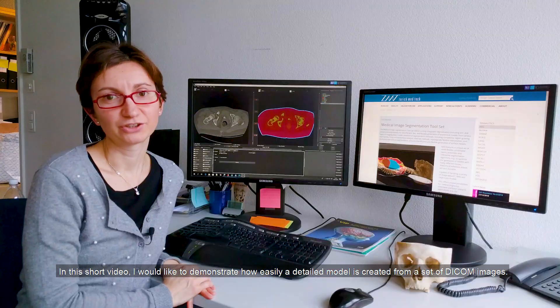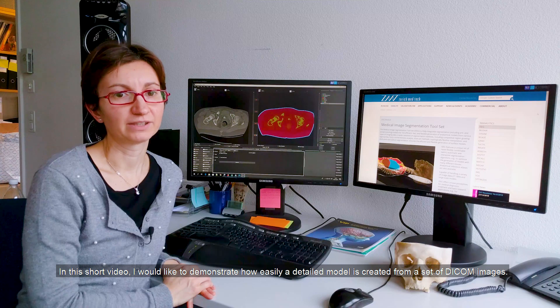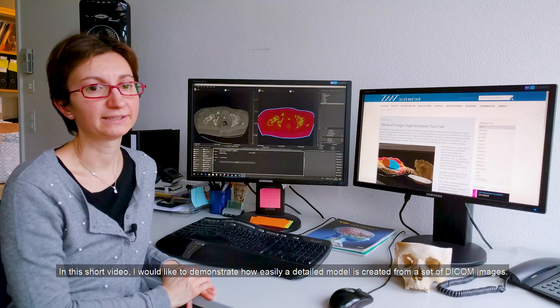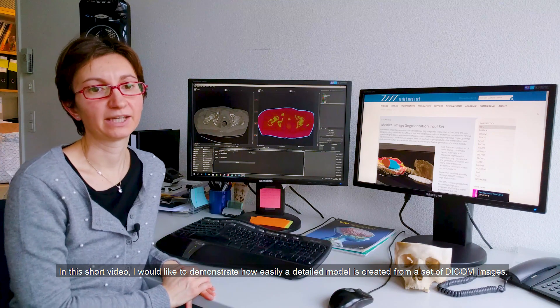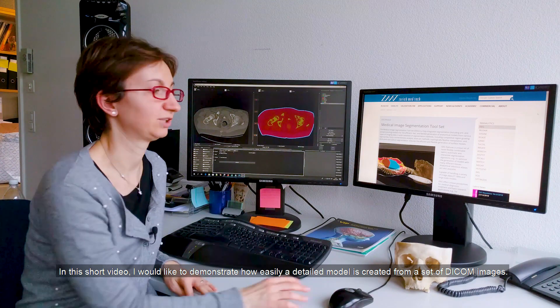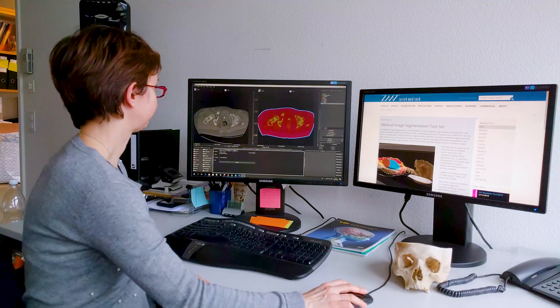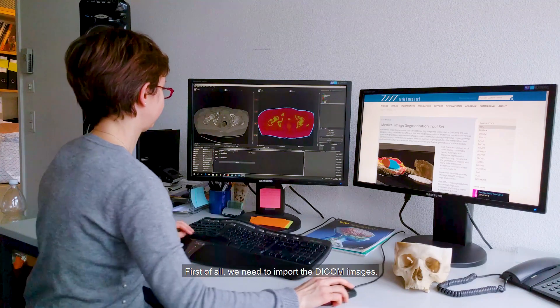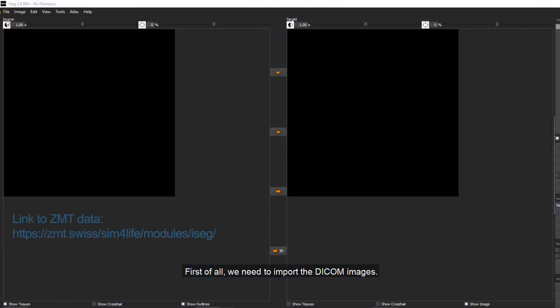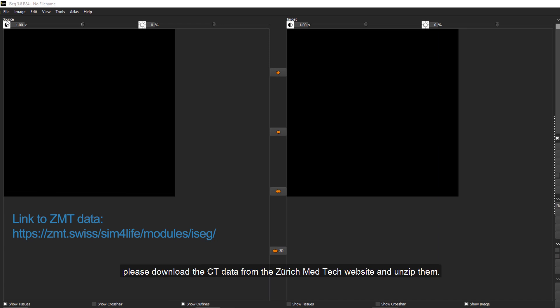In this short video, I would like to demonstrate how easily a detailed model is created from a set of DICOM images. First of all, we need to import the DICOM images. In order to follow this tutorial step-by-step, please download the CT data from the Zurich MedTech website and unzip them.